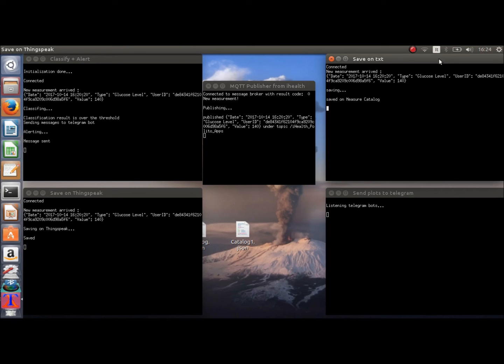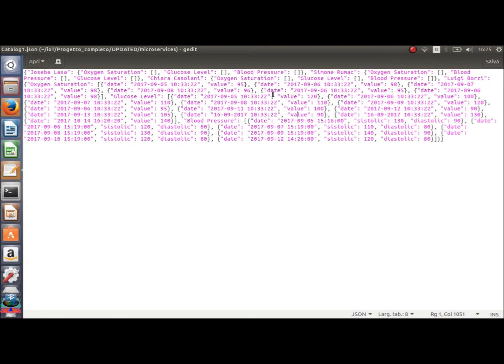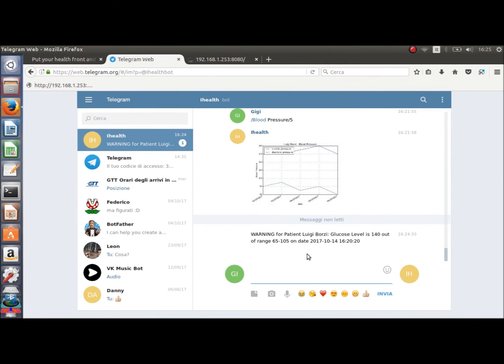Let's check if it works by opening the JSON database. This is it. And under glucose level, this is the measure. The classify-plus-alert one checks if the measure value is out of its physiological range and eventually sends an alert message to the Telegram bot associated with that patient. Let's check if the Telegram bot receives such a message. That's it. There is a warning with the parameter value, the range, and the date.